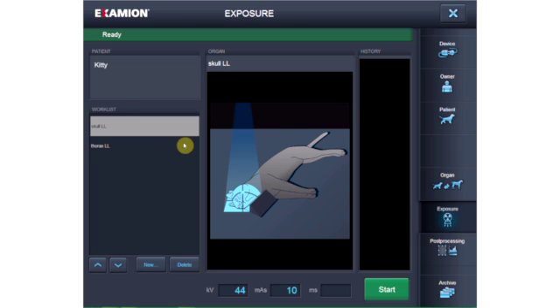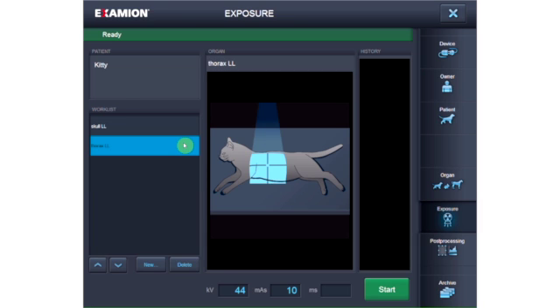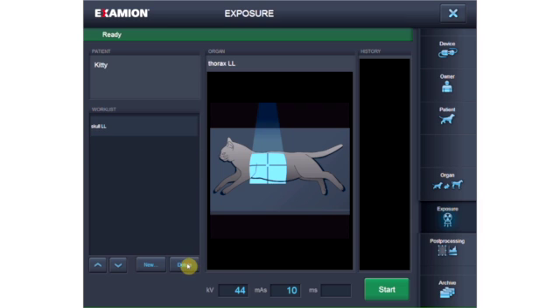The positioning images aid you in positioning the patient correctly and collimating the organ to be x-rayed. The worklist contains all the pending x-ray orders. An order can be deleted or regenerated.